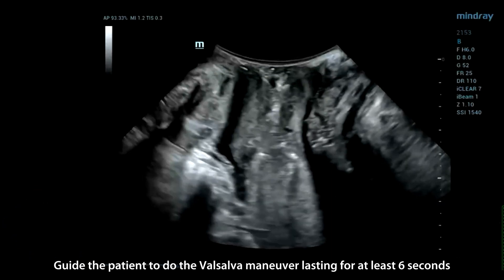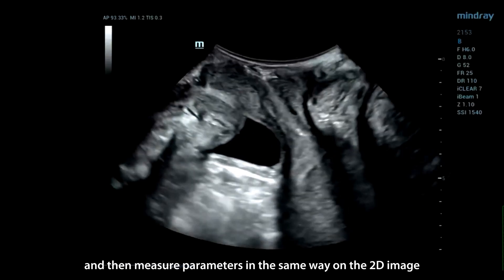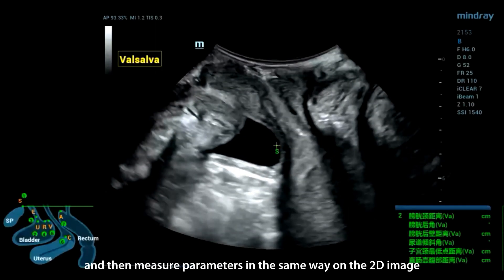Guide the patient to do the Valsalva maneuver lasting for at least 6 seconds, and then measure parameters in the same way on the 2D image.